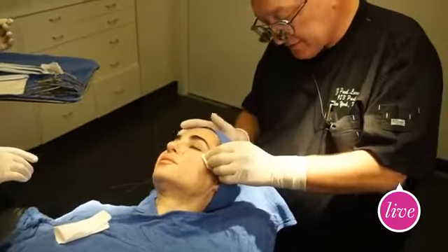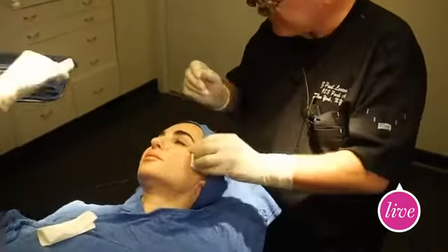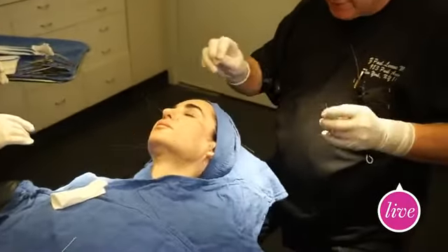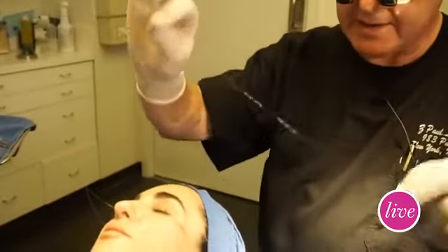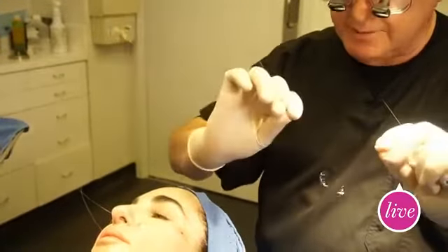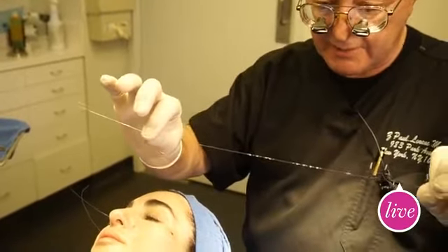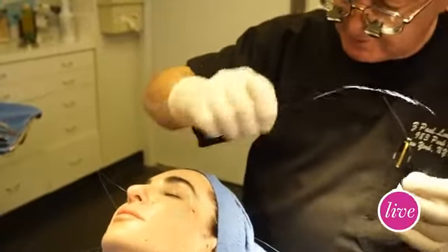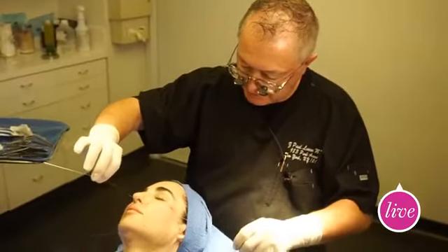So what Silhouette does, let me have a suture so I can just show while we're talking about it. Okay. So Silhouette InstaLift is a product approved by the FDA for use in lifting the midface. And it has these little cones made out of poly-L-lactic acid and polyglycolic acid, and they are on a particular suture that comes with 2 needles. And these knots, as I'm tightening the knots right now, keep the cones from slipping. So what I do is go to the insertion point, go one way and then the other way with the needle. So imagine that the suture is being placed like this.